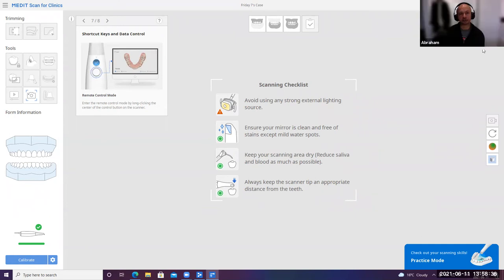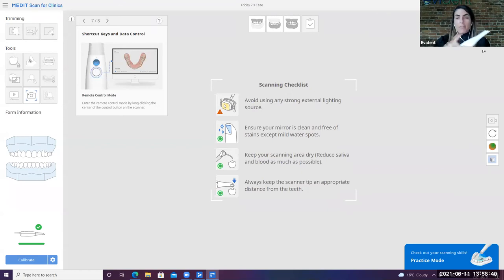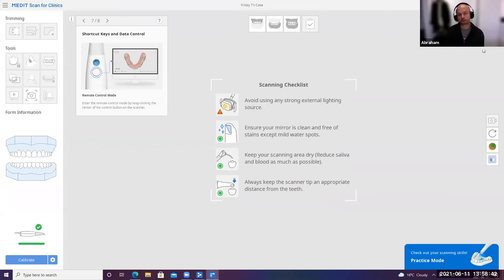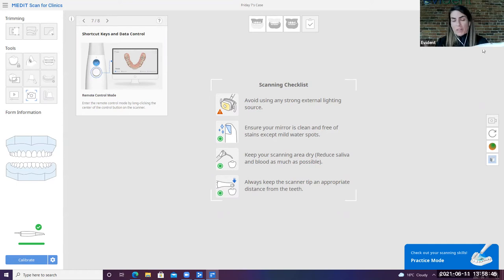I see. I got it. So I can control it with the scanner itself. Yeah, with the scanner itself, so that it takes you away from having to go back to a mouse that you may have trouble disinfecting afterwards.